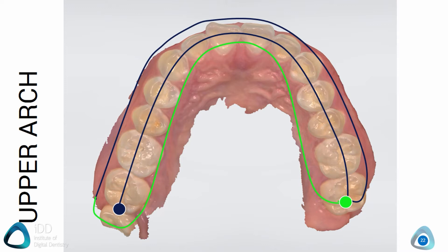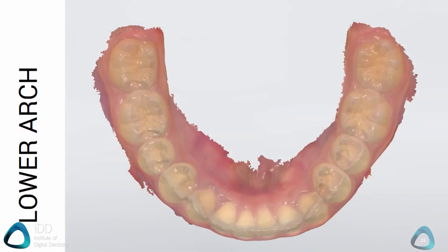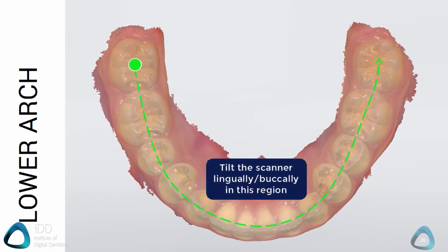There are likely some areas with missing data, which you can easily add to by re-scanning. The bottom arch uses the same protocol as the top. Start posteriorly on the occlusal surfaces, then move towards the occlusal aspect of the molar on the other side of the arch. Again, in the anterior region, you may need to tilt the scanner so you don't lose alignment, which will cause the scan to stop.